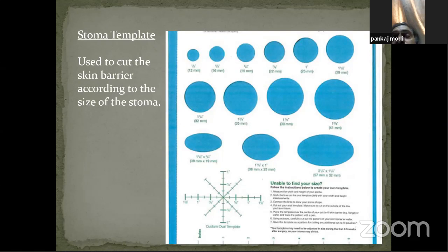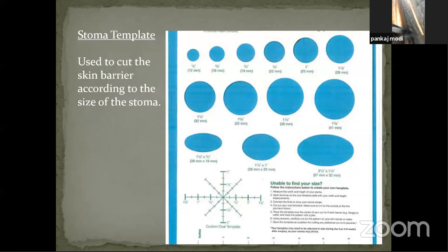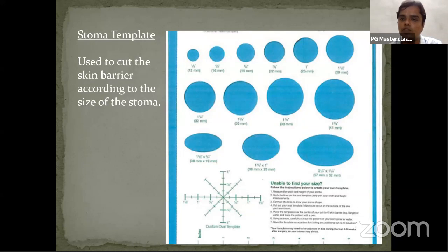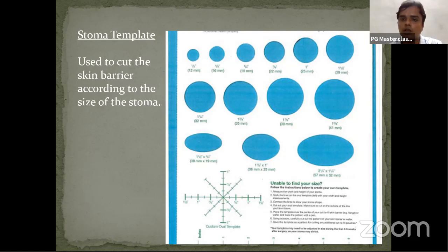What will it do? Sir, why we should always apply the stoma bag as early as possible is because the leakage of content, or if the stoma gut is functioning, it will lead to skin excoriation. But suppose in 24 hours, will it cause skin excoriation? No, sir. It will cause surrounding soiling of the skin, sir, and chances of infection will be more if we don't apply the stoma bag.